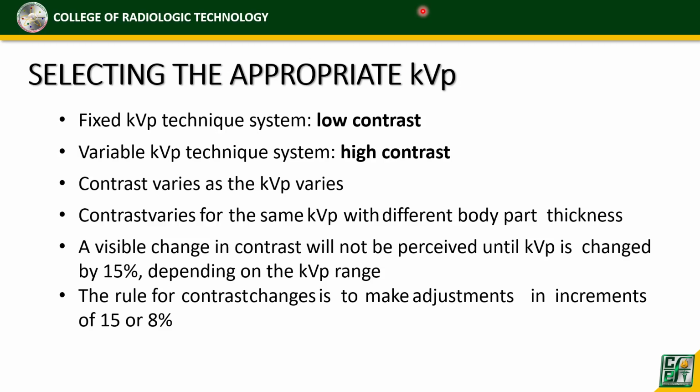May shade na blue yung film natin, di ba? Kasi kapag kumuha ka ng film sa box, okay, at na-expose mo siya sa light, ang color ng film natin ay violet. Violet siya na parang frosted glass, malabo. Okay? Pag na-develop siya, itim siya lahat, yung buong film. So, bakit ganon? Kasi na-expose siya sa radiation.